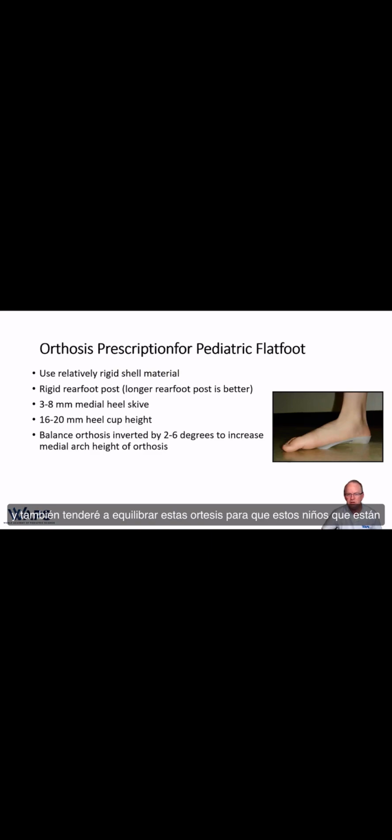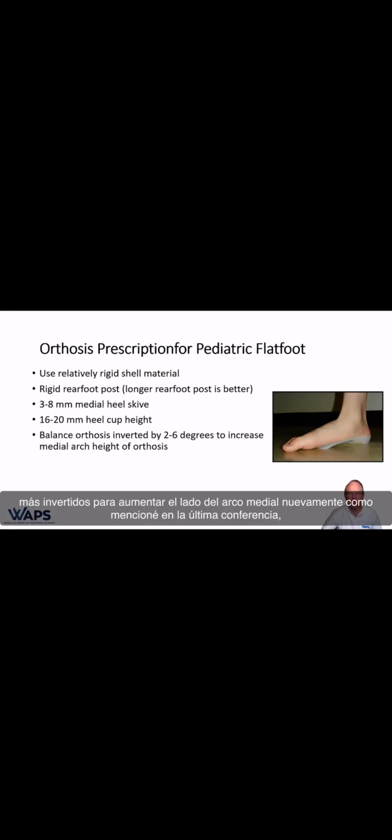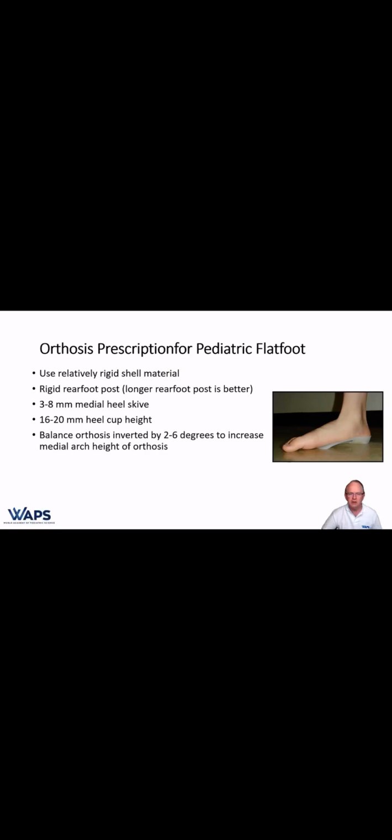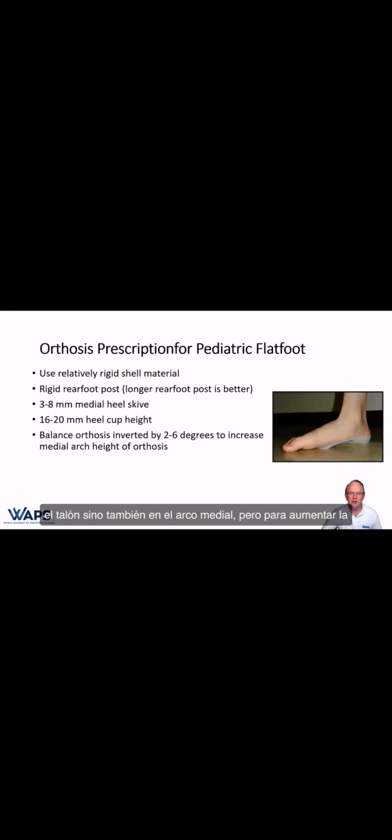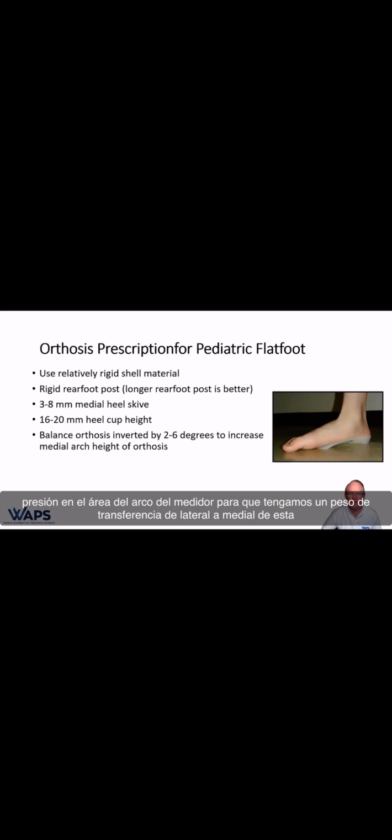I also will tend to balance these orthoses for these children more inverted in order to increase the medial arch height. Again, as I mentioned in the last lecture, the best way to treat flat foot deformity so that we can increase the supination moment, not only in the heel but also in the medial arch, is to not only use a medial heel skive, but to increase the pressure in the medial arch area so that we transfer weight from lateral to medial.